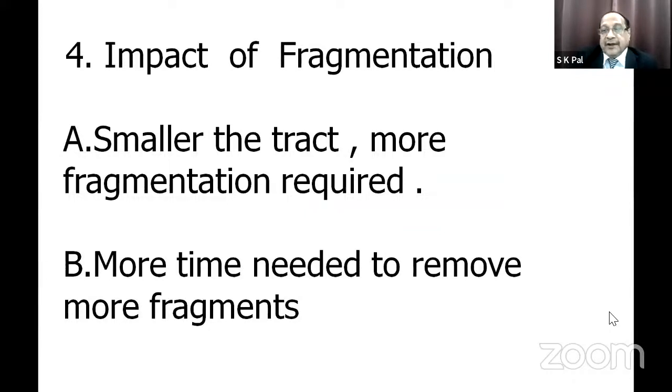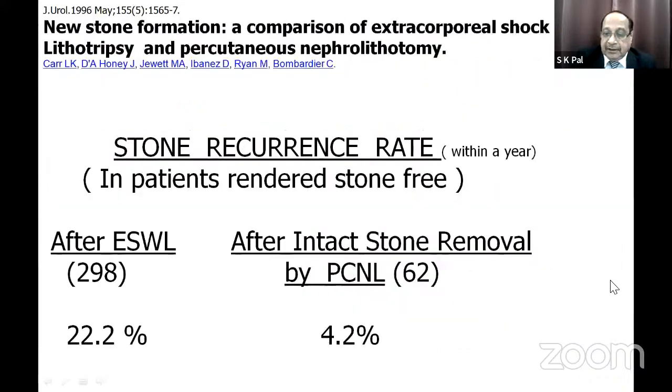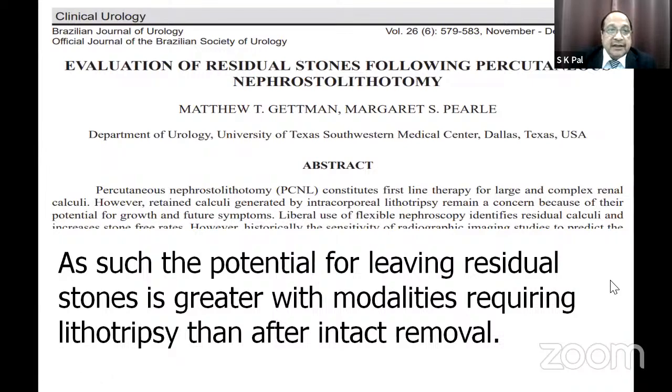Regarding impact of fragmentation, this is the point which we should understand. If the tract size is smaller, there is more fragmentation required. And when there are more fragments, the time taken in surgery will also increase. This is a very logical understanding. Now, this paper had appeared way back in the Brazilian Journal of Urology in 2000, and it really made me think about this.